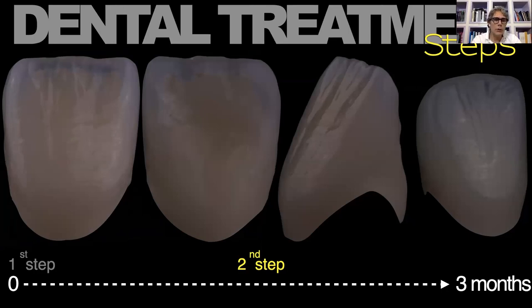As you can see from this chart, the aesthetics of the final restoration were amazing, and the most important thing to consider about this restoration is the transparency on the incisal edges that is typical of the four upper incisors, which shows us the profile of the dentin mamelon and gives a natural appearance to the restoration after cementation. And thanks to the textures that I sculpted before polishing the frontal teeth, the texture gives a more natural appearance, because it breaks the light reflected onto the buccal surface.